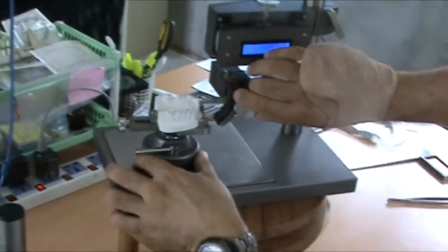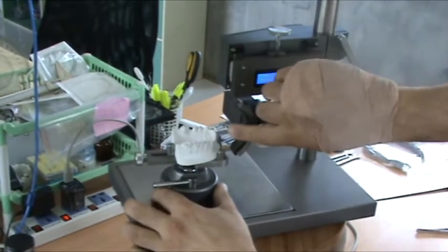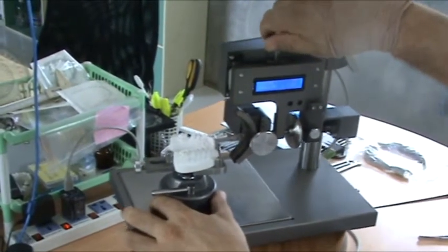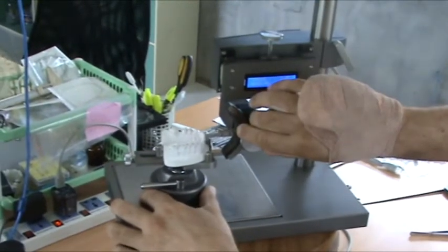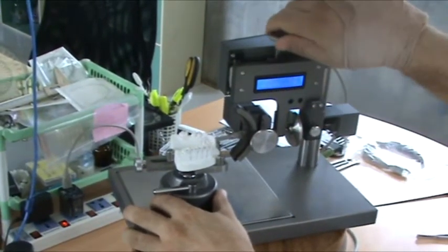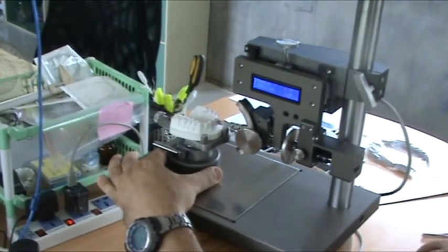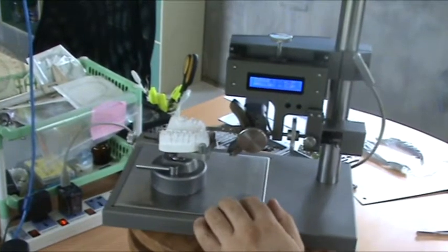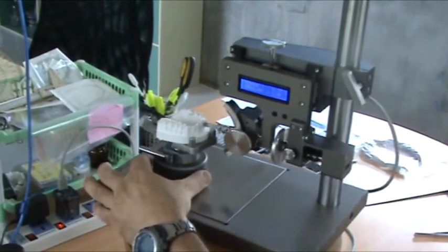And then this adjustment here gives us our torque. As I change the blade, my corresponding middle of the blade with the FA point has changed, so I just adjust the height a little bit. And torque. The trick is also not just to fit the blade to the tooth. Here, so measuring torque, and we see that tooth retroinclined, so we have a torque of minus 4.3.